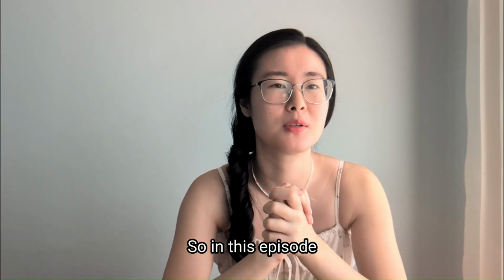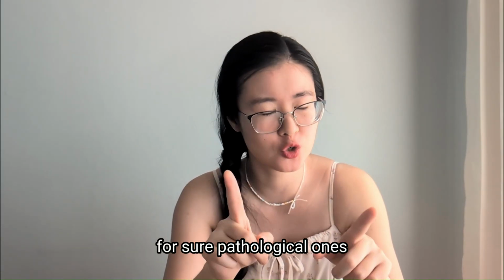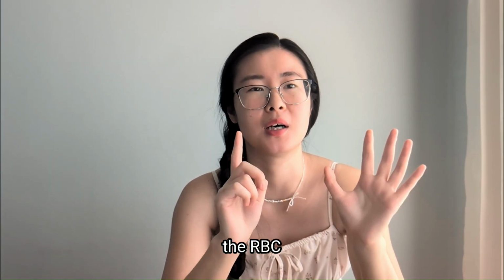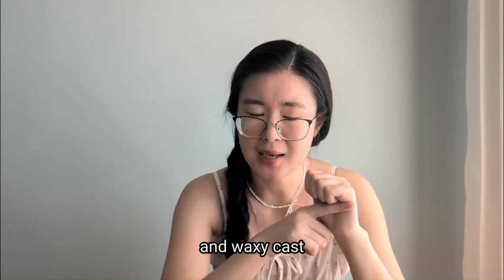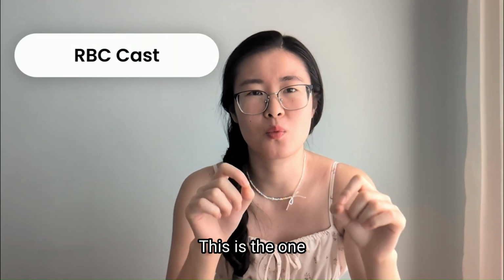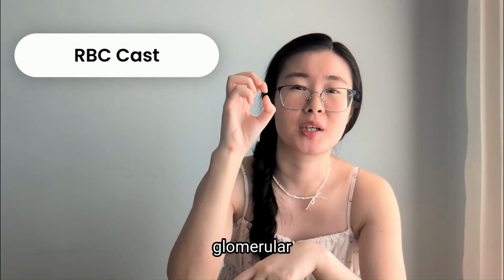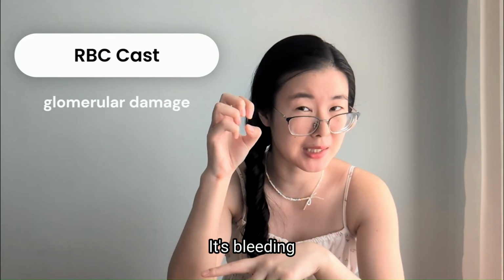So in this episode, we're gonna focus on the absolute, for sure, pathological ones: the RBC, WBC, RTE, fatty cast, and waxy cast. Start with the RBC cast. This is the one when your little glomerulus got damaged. It's bleeding.